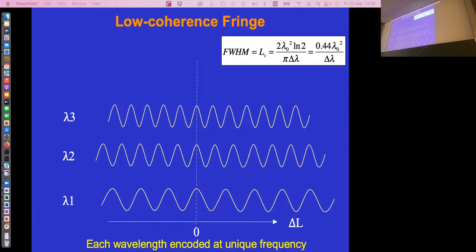And now I want to look at the interference between these two waves. What do I write down to get the intensity? I write down the intensity is E1 plus E2 multiplied by its complex conjugate. And that is how I turn electromagnetic fields into intensity. I multiply the field with the complex conjugate.